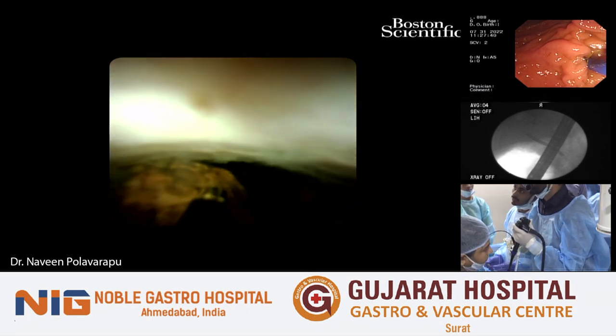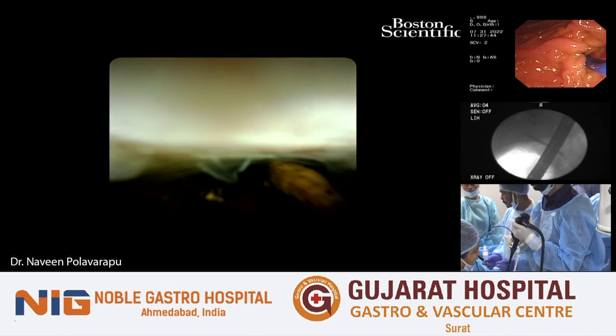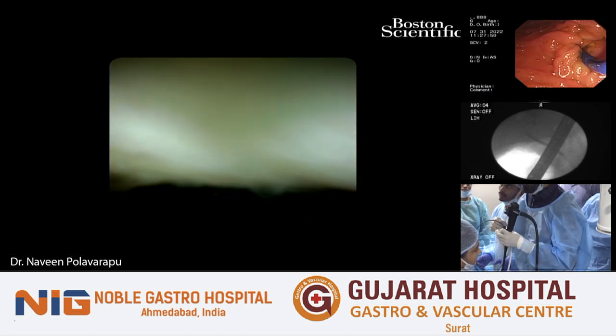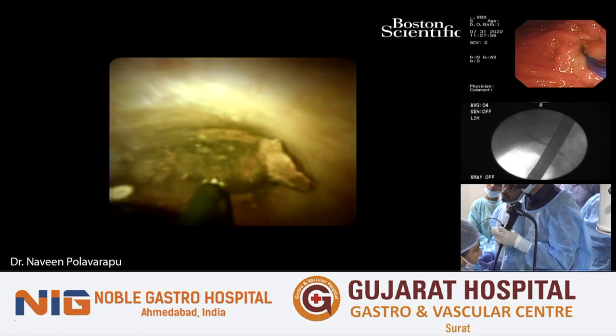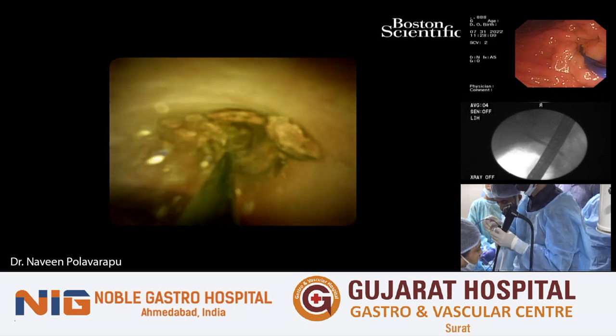So I just used a low pulse, and then three pulses and a low power. So most of the times it should be fine. But yesterday I happened to do a 2.5 centimeter stone. Yeah, you can see it's nicely broken now. You can see the shaved parts of the stone as well. Yes, sir.